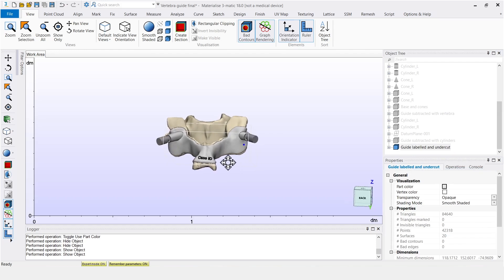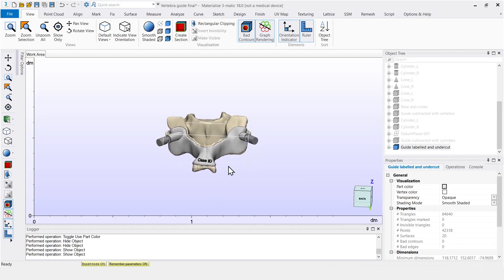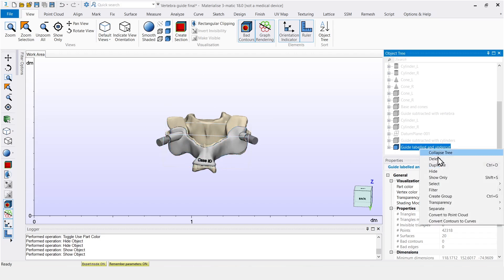This example is not necessarily clinically accurate, but it contains the essential elements like a base, drilling holes, and a label. Let me show you how I got there.